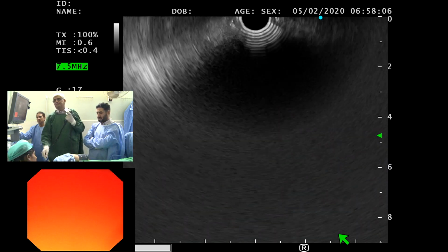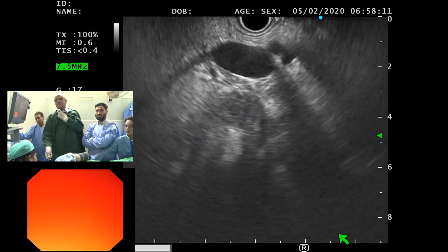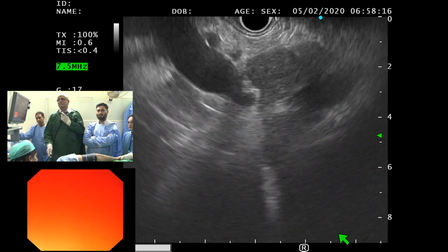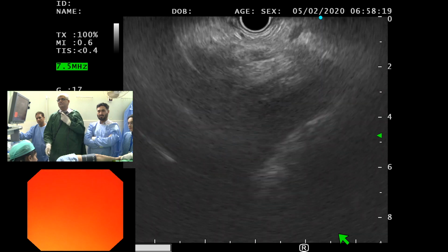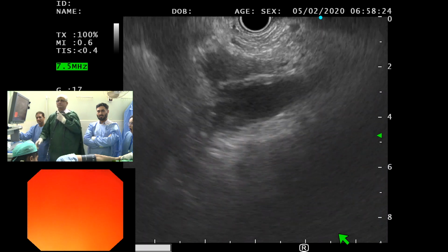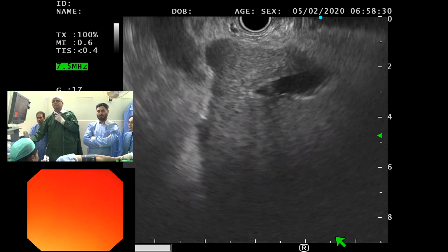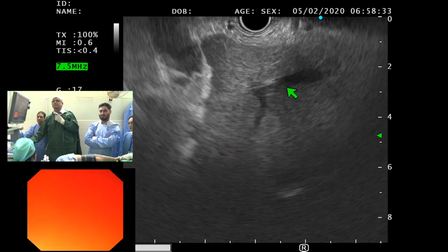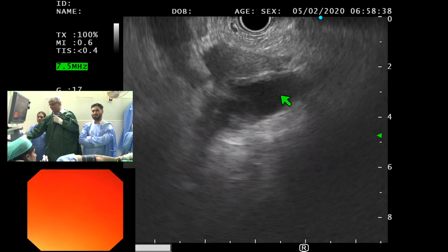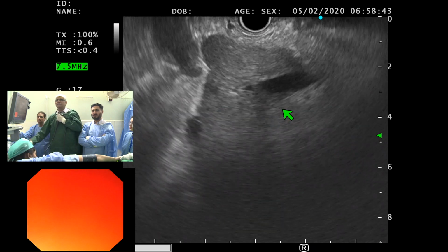Okay? Yeah, we are now in the stomach and looking at everything. These lymph nodes are obviously ominous here. She's definitely got malignant tissues. Doc, what is this? What is this? What is this? It is a vessel and this is also a vein. What could it be? It's in the liver. Intrahepatic IVC there. Okay?